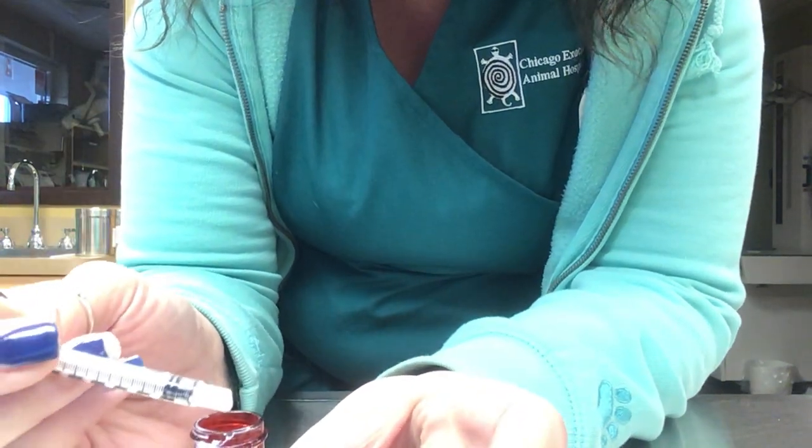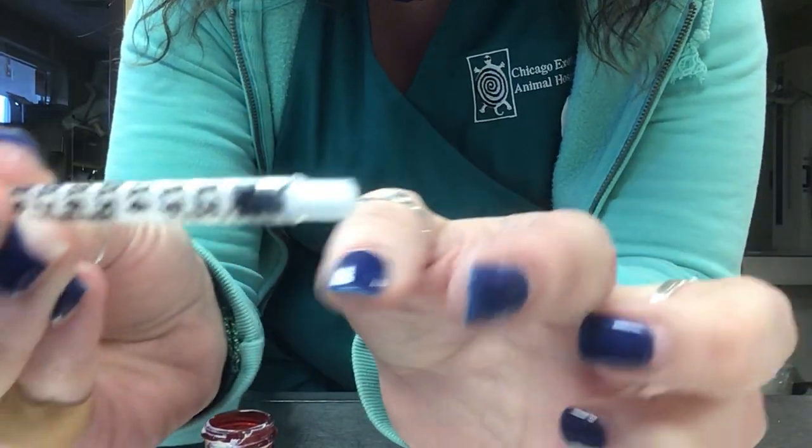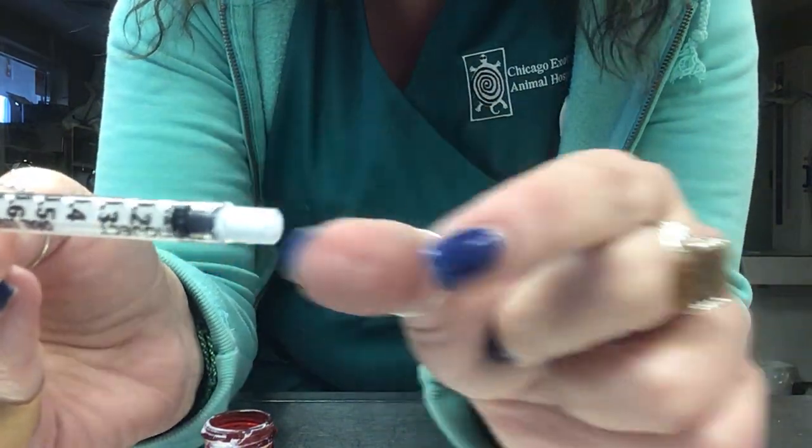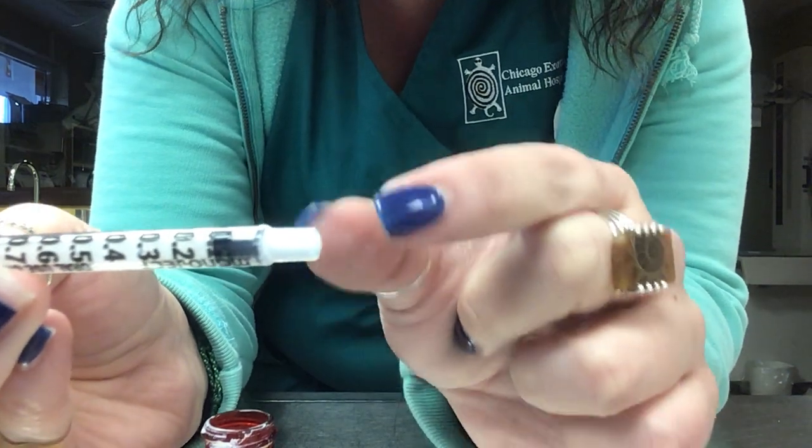Once you give the medication, there will still be medication in the tip of the syringe after it is completely empty. The plunger will be all the way to the end, but there will always be medication remaining in the tip.